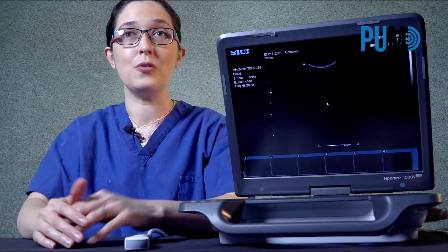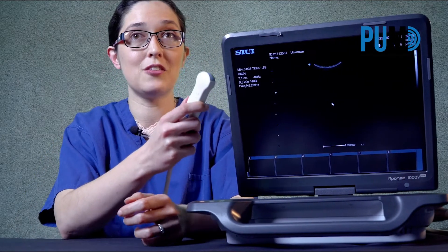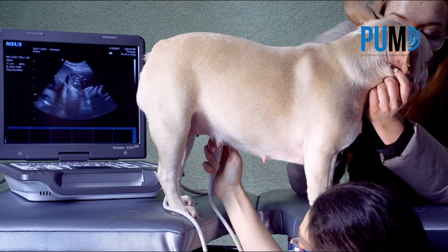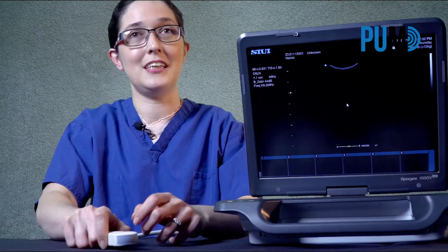If you're only scanning small animals, you can do pretty much everything with just a micro-convex probe. Fantastic B-mode and colour doppler images and really nice cardiac imaging too. In terms of value for money, the Apogee 1000 Lite has to be the best ultrasound machine I've come across.